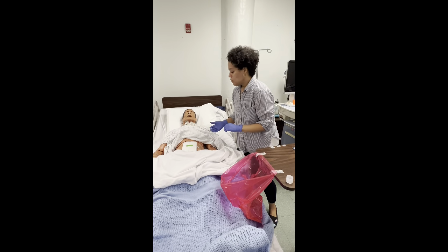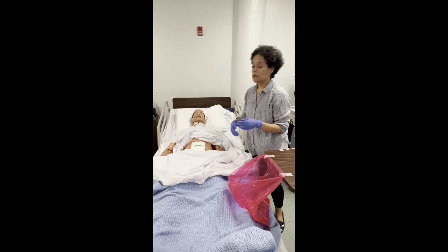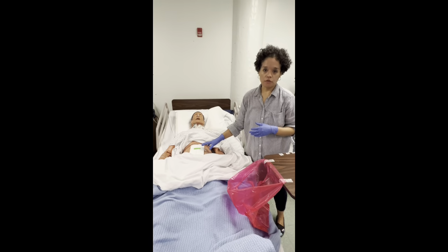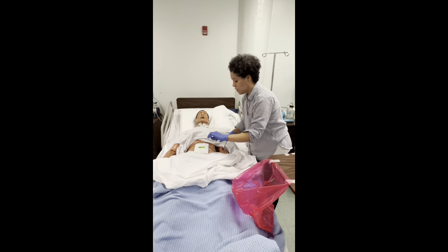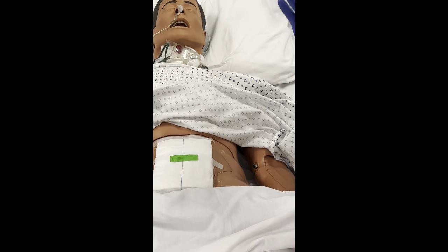Okay, so with my non-sterile gloves, I will be removing the old dressing, and from there I would be assessing both the old dressing as well as the surgical site, and I will guide you as I perform so. So as you are removing the tape, make sure you do a pull and push down method.